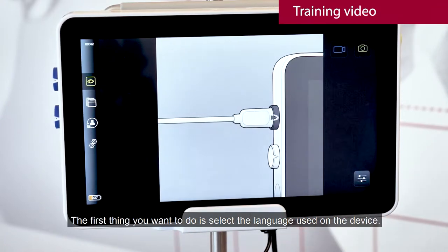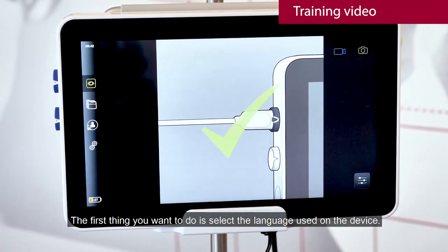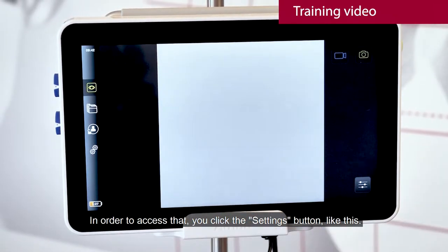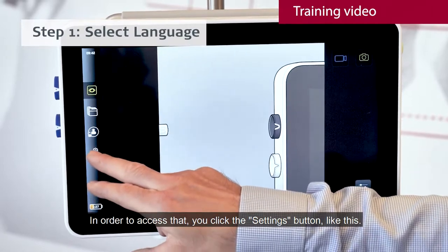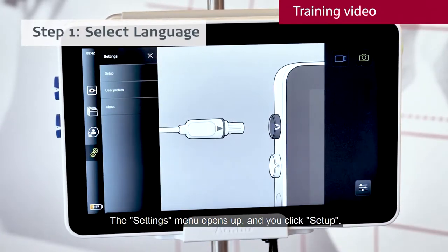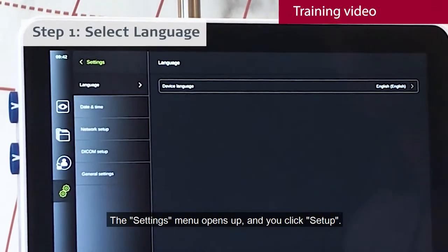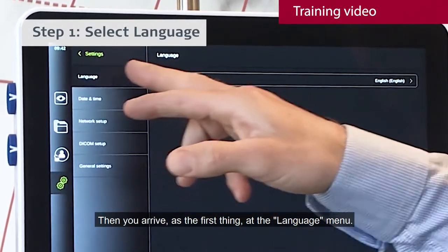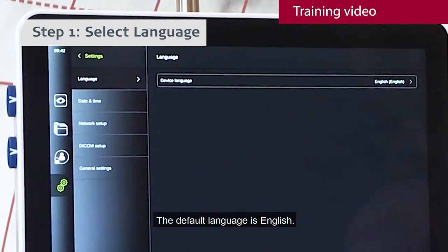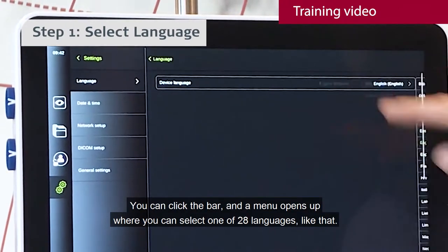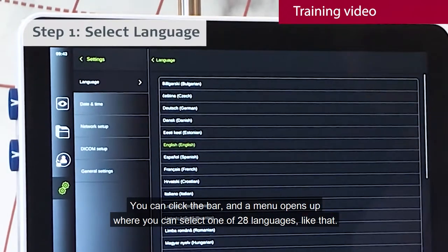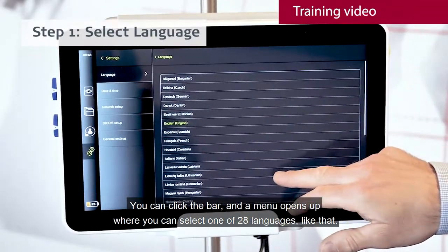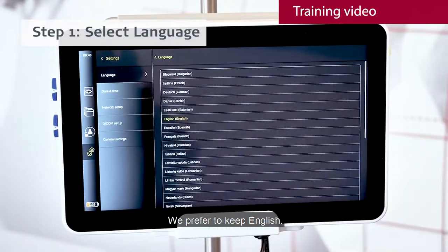The first thing you want to do is select the language used on the device. To access that, you click the settings button. The settings menu opens up and you click setup. The first thing is the language menu, and the default language is English. You can click the bar and a menu opens up where you can select one of 28 languages. We prefer to keep English.